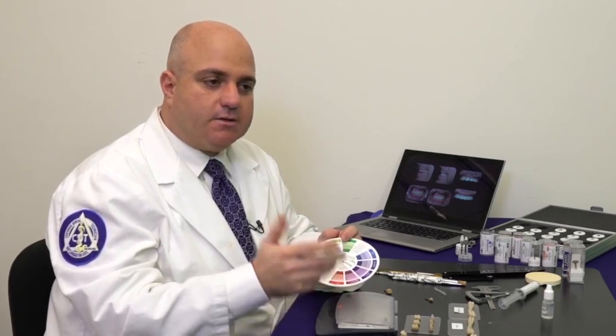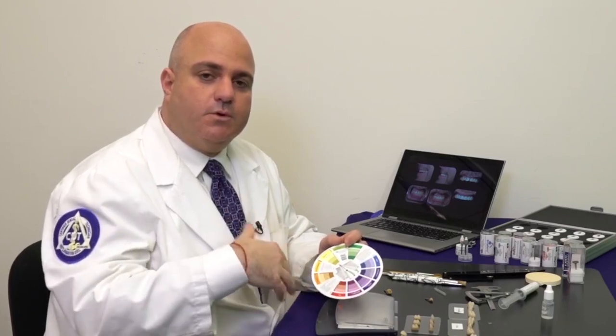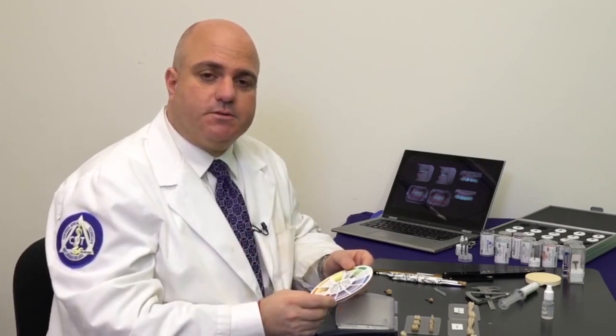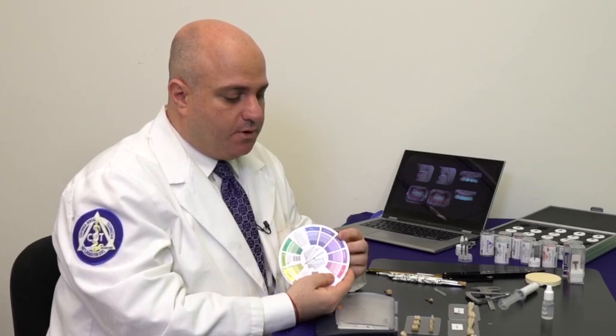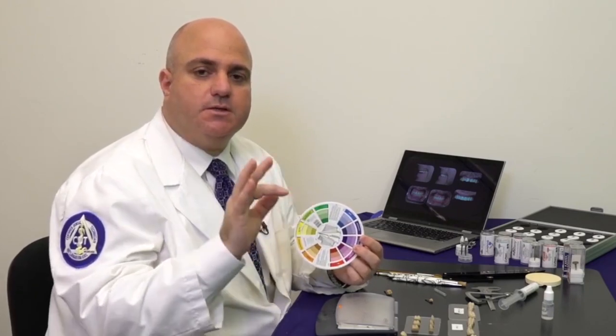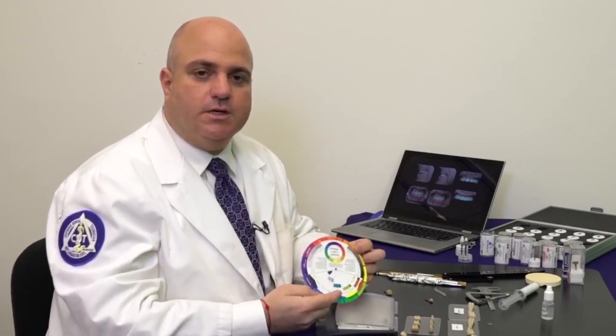The color wheel also addresses value. If a doctor wants an A2 with a high value, start with a lighter color and add the chroma. If they want an A2 with a lower value — meaning the chroma of A2 but duller or more gray — you need to add the complements. For example, for A2 you would add the violet, which will tone down the value. Understanding the colors and how to manipulate them gives the best results. On lighter A and B shades use blue and white contrast; on C and D shades use gray and white — this contrast gives the eye the illusion of looking deeper and seeing more layers.